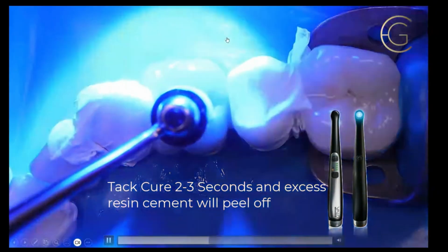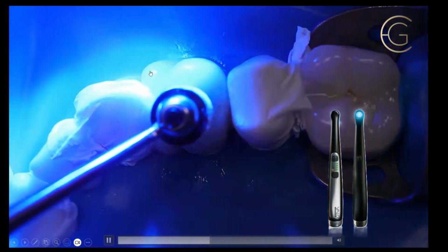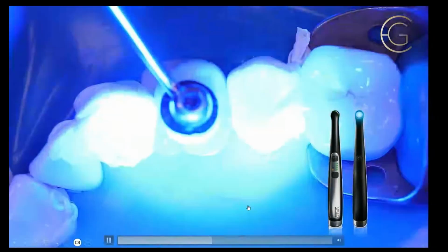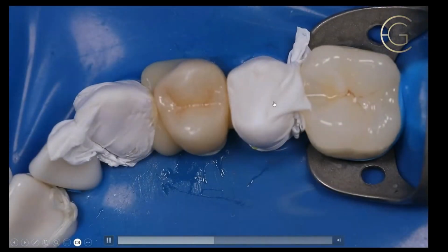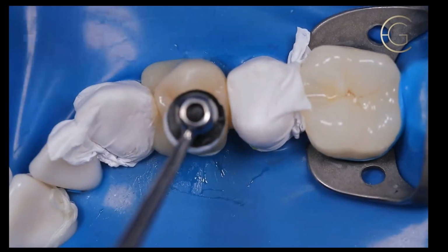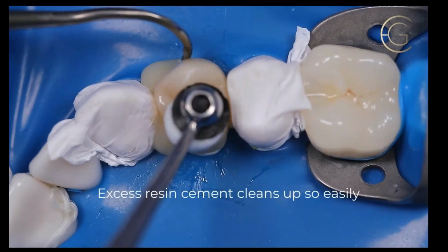When you tack here, you stay about an inch or two away from each embrasure, and this is going to peel off. You feel guilty. It's almost like stealing. It's so easy to clean this up. So with your light, you're going to have to experiment with how much you need to tack. Some lights may be 2 seconds, others may be 3 to 5 seconds, and then watch, it just peels right off. I'm using a sickle.